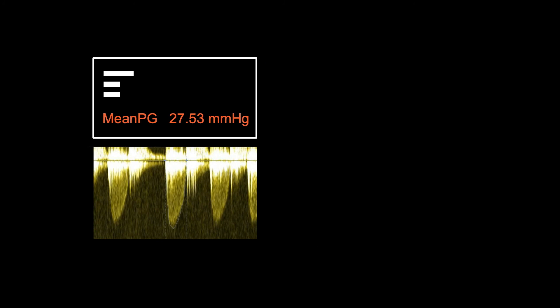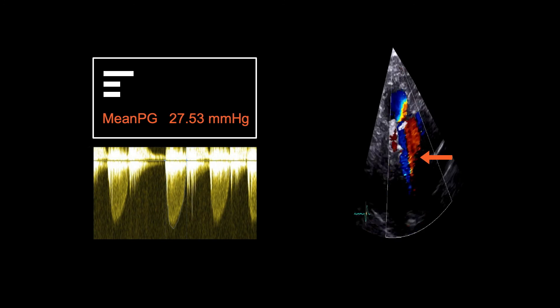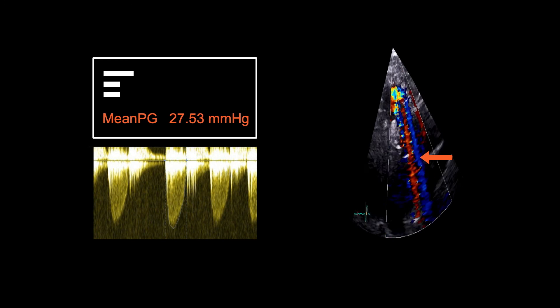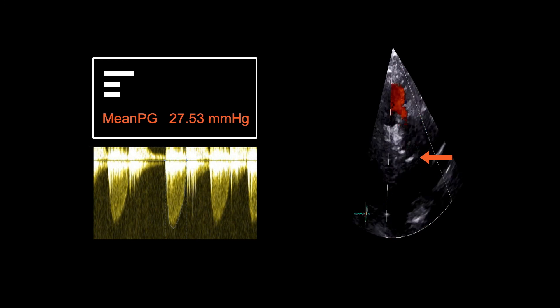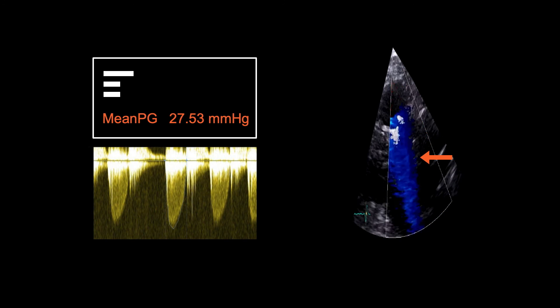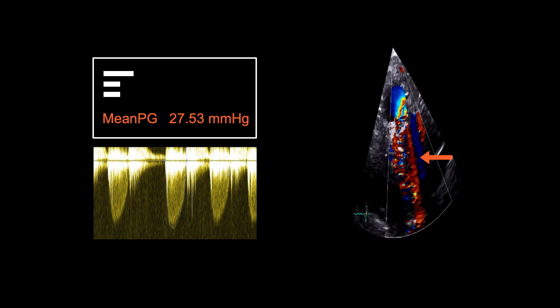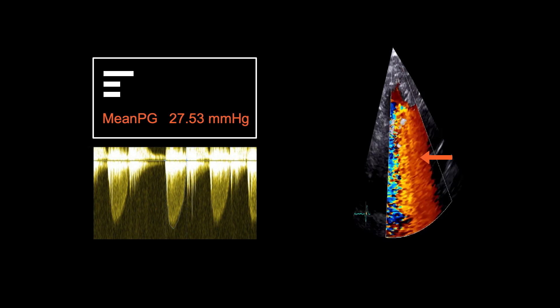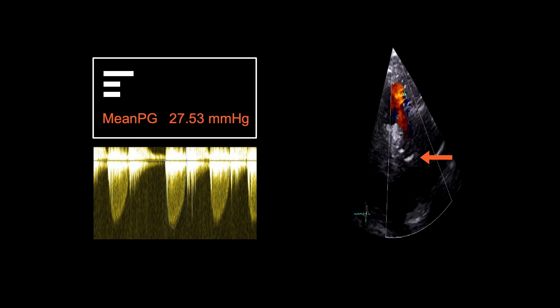His mean pressure gradient was 27.53 mmHg, which suggested severe pulmonic stenosis secondary to endocarditis, and significant pulmonic regurgitation was also observed. Consequently, he was re-referred to the cardiac surgical team for a redo of the pulmonic valve.